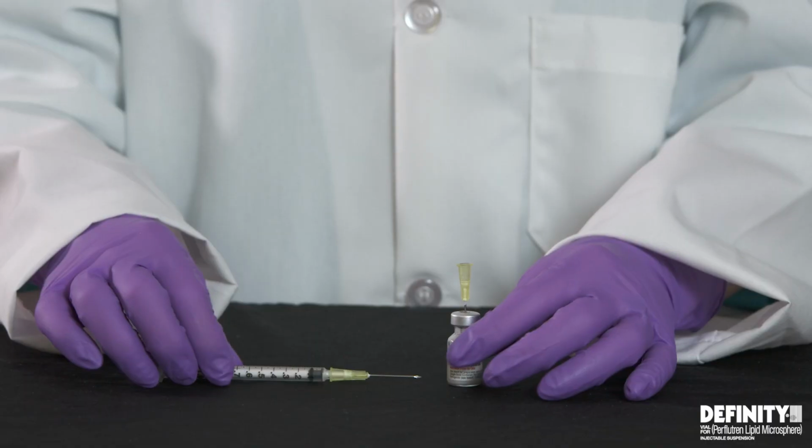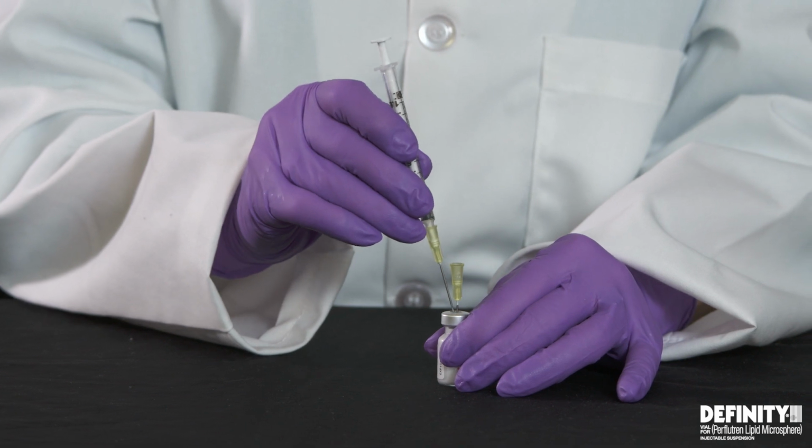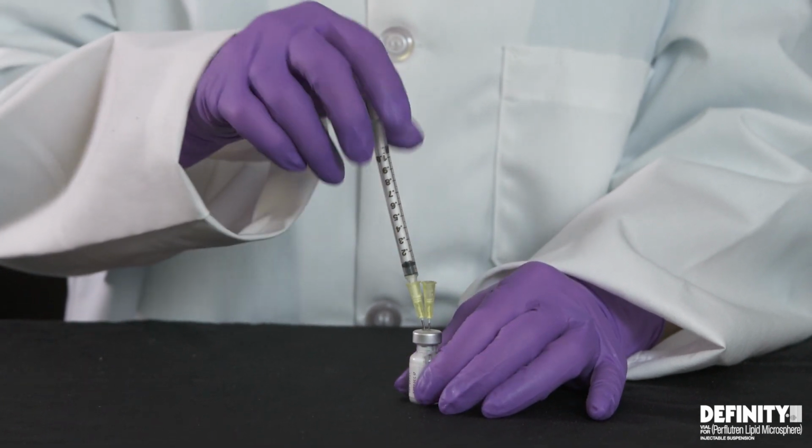When using a needle, it is important to vent the vial. Venting avoids negative pressure in the vial, which allows for easier withdrawal and prevents microbubble disruption. To withdraw activated DEFINITY, take the 3 milliliter or tuberculin syringe and attach an 18 or 20 gauge unfiltered needle. Insert the needle into the vial. Do not inject air into the vial.